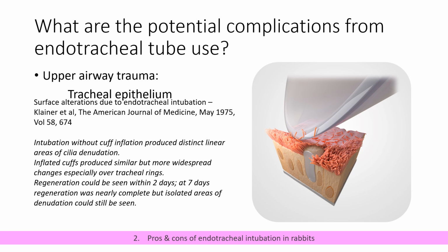And particularly in rabbits who have quite significant lower respiratory tract infection, often as a result of bad breeding or bad husbandry, that could be very significant indeed. And you may be getting animals with lower respiratory infection as a direct result of your anaesthesia. And that's not a question of how you intubate. That is inherent in passing something down the trachea, so you need to consider it as a complication every single time you intubate any mammal.